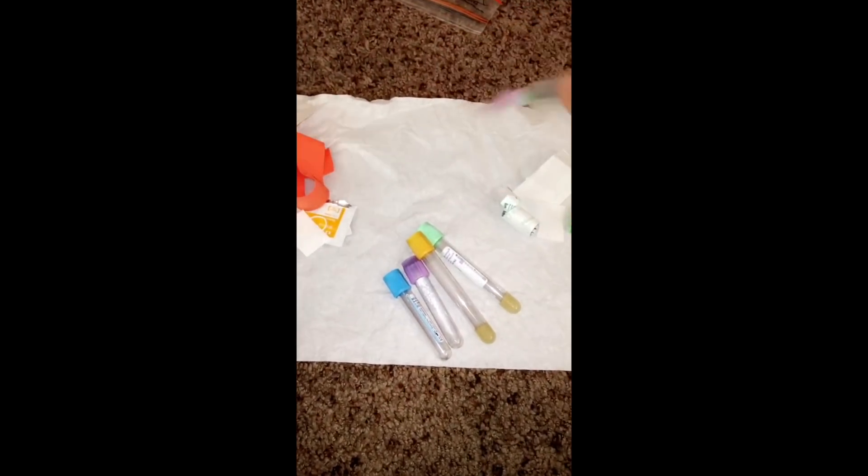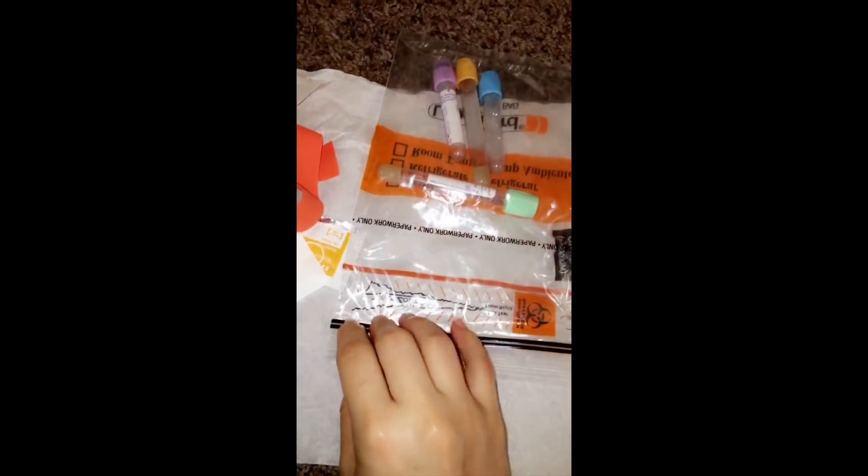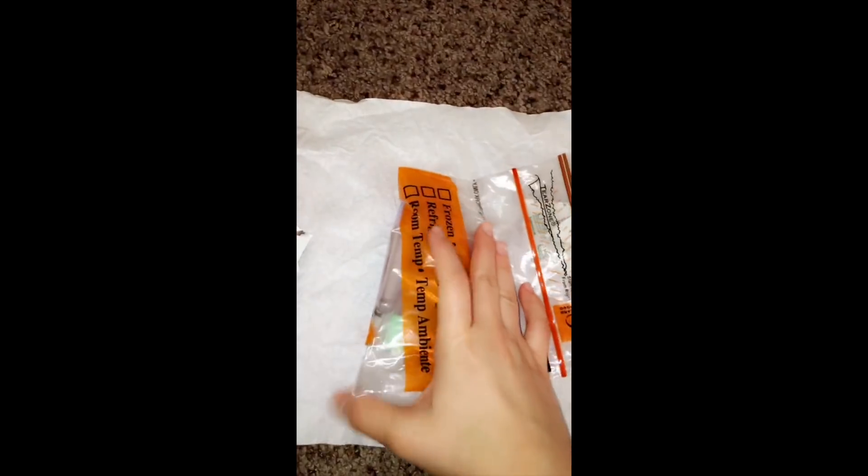Sorry if I sounded rushed — the problem is I had to record it from my phone on Snapchat, which won't let me post if it's more than a minute. Earlier when I was talking about not having everything I needed, I was referring to the butterfly — there's one more piece that you would need to connect to the butterfly to be able to use it. So at this point, now that you're done, you would take your vacutainer and toss it into the sharps container. You would take your tubes, label them at the bedside, scan them in the computer, and then put them into your specimen bag. Make sure you seal it very well, and then depending on where you work, you could tube it down to the lab or walk it to the lab.